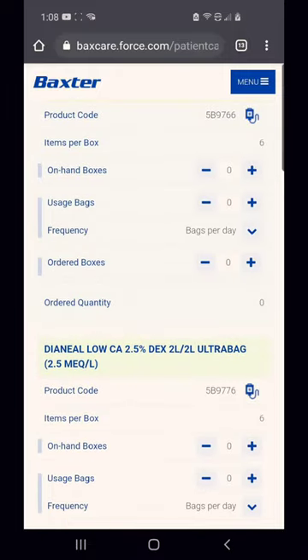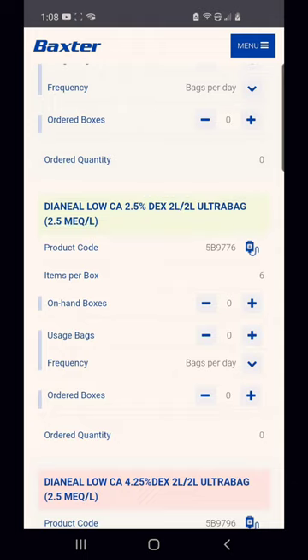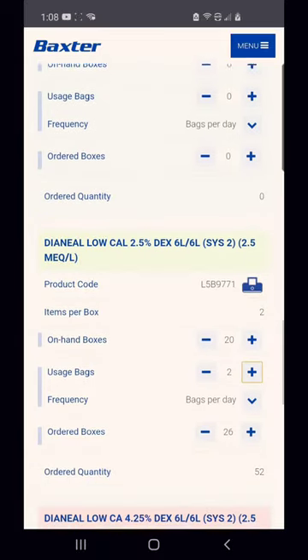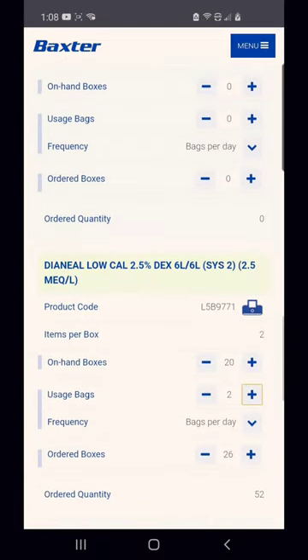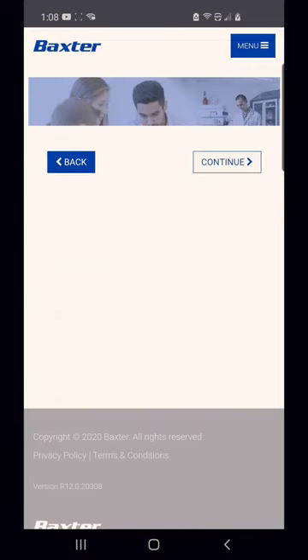On hand, I do keep a couple of the manuals for 2.5% also, just in case something happens, you know, I have extras. If you do have to do a manual through the day, because I know some people have that prescribed by their doctor, then obviously you would have to do this section as well. So this part is done. I already did all the boxes I need for this month. So I will click continue.